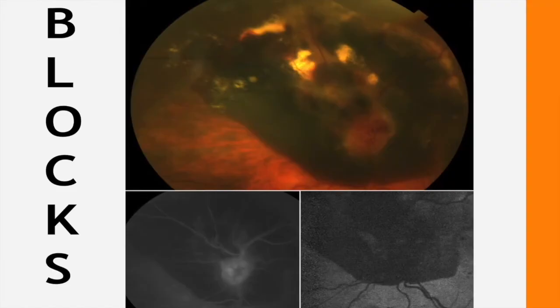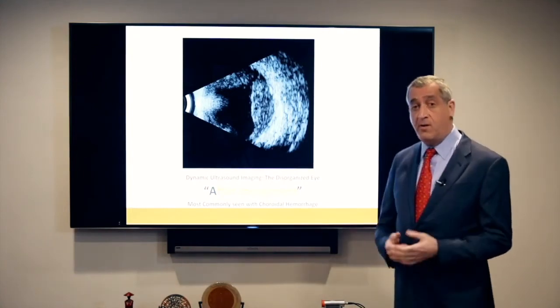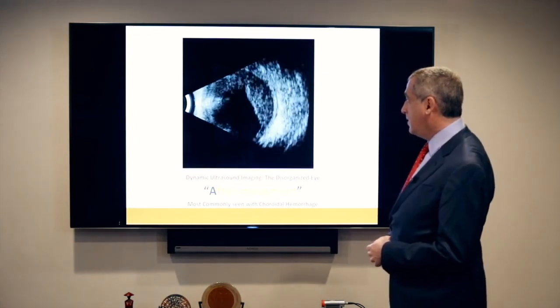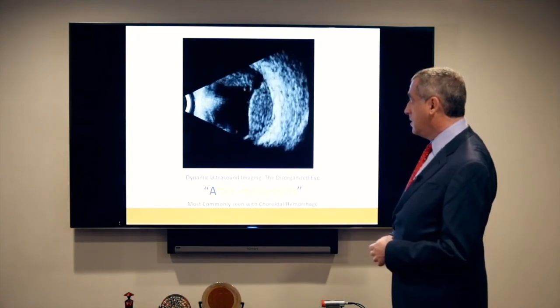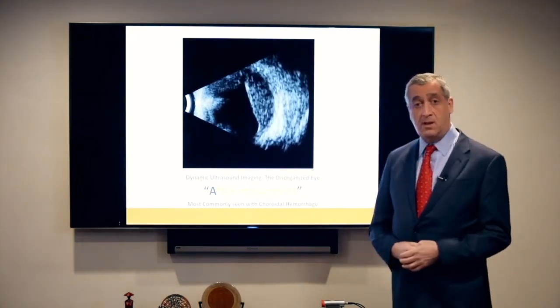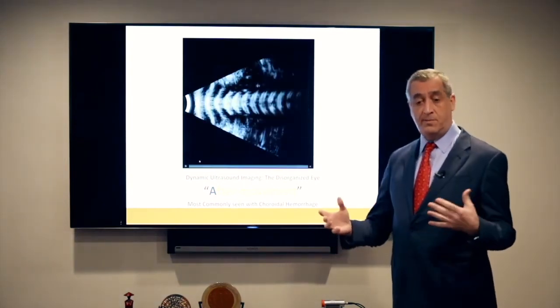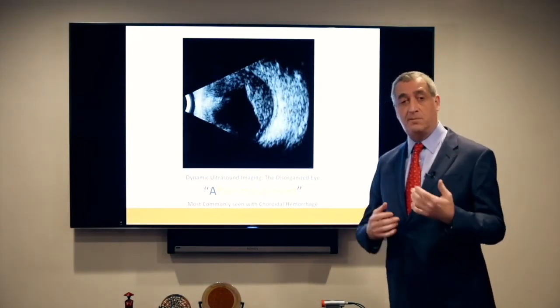And here's the other end of the spectrum. This is a giant choroidal hemorrhage circling the optic nerve. Again, blackout on fluorescein angiography, early and late. So let's look at after movement. After movement is a very specific finding on ultrasound. Here, when you move the eye, the contents sludge. There's no twinkling like the vascular pattern with a melanoma. There's just this after movement of material that's underneath the retina that can't stop until it comes to rest.